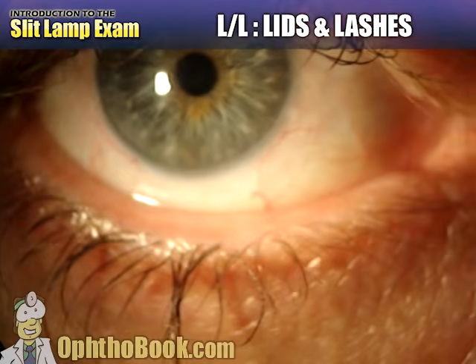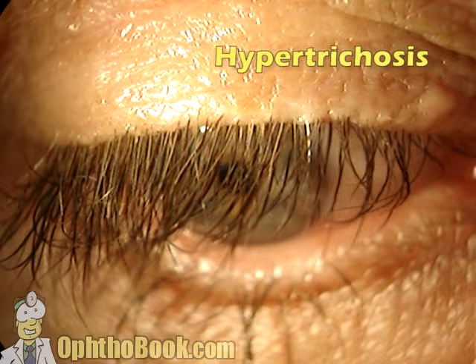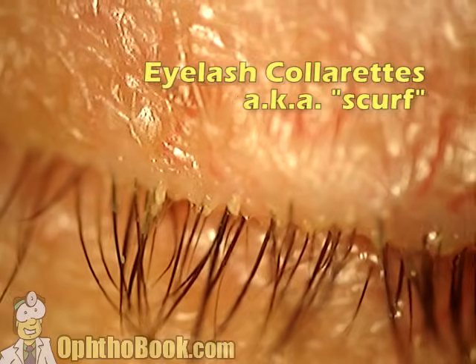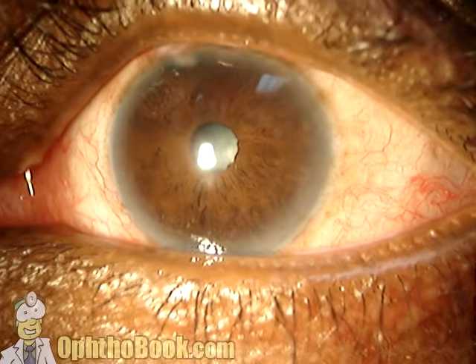At first glance, these lids and lashes look normal, but if you look at the sheer length of these lashes, this is a patient that's been on Xalatan for many years and has the lash growth that some people like. Collarettes, scurf, and junk on the base of the eyelashes. You see this with anterior blepharitis.